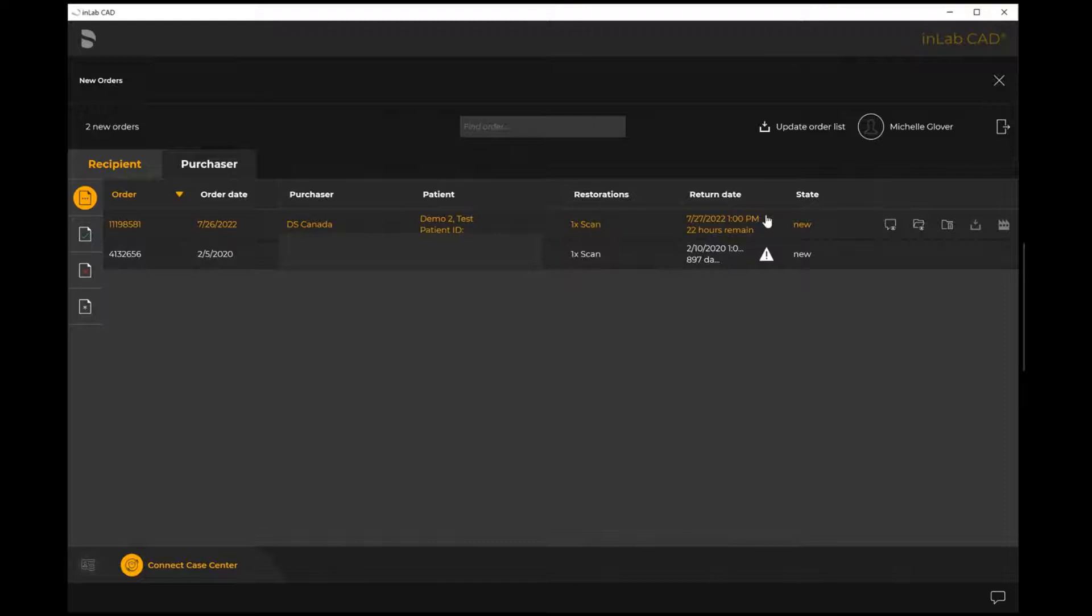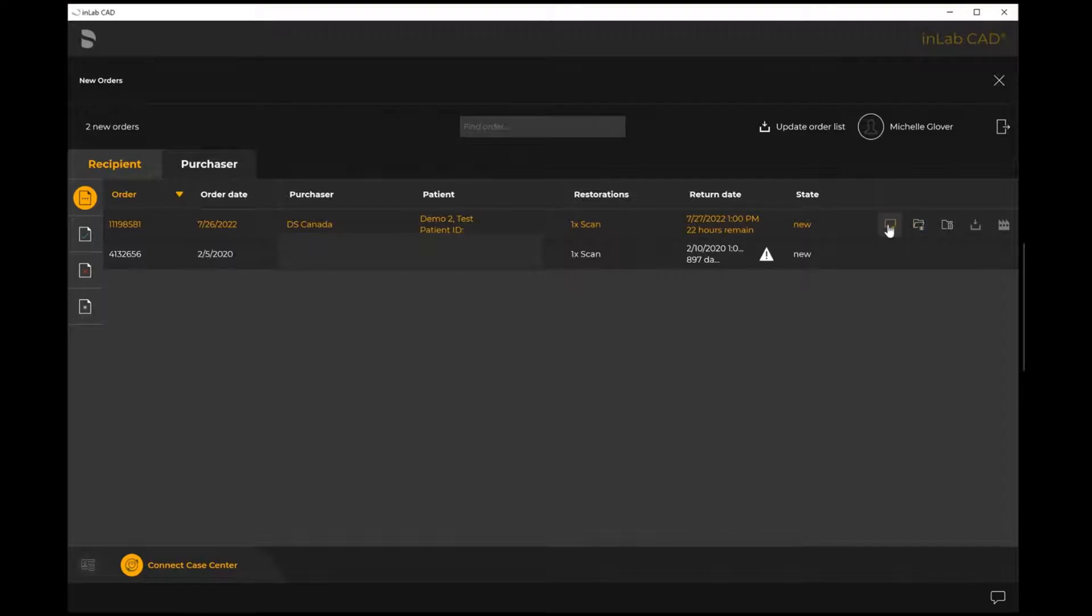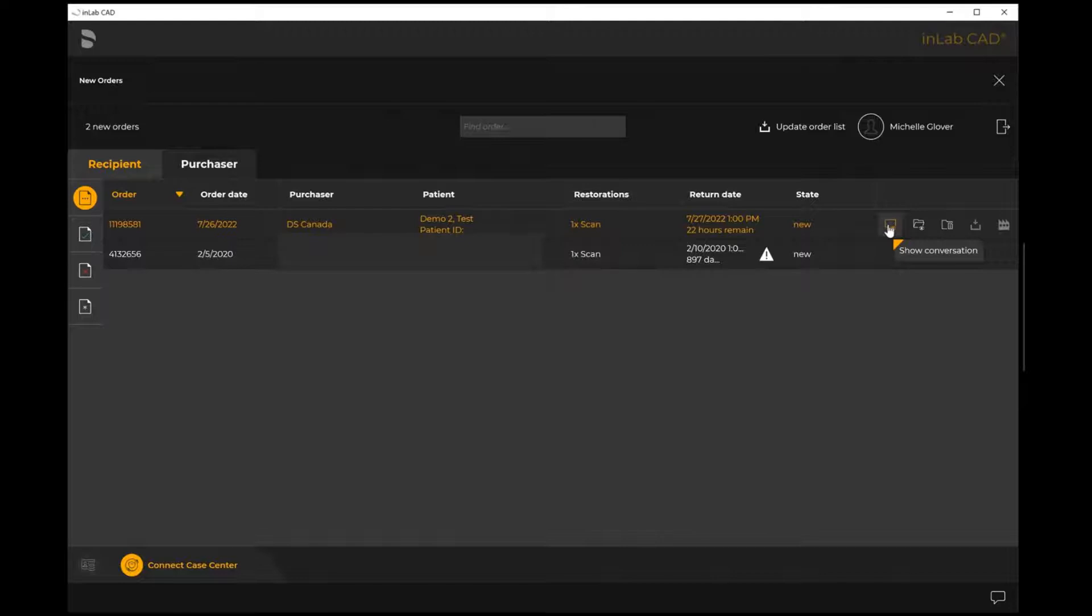As soon as you highlight a case, it'll highlight in that orange color. You'll see right next to it there's three available offerings. The first one show conversation - that would activate a chat between ourselves and the purchaser. It's like a Facebook messenger or an Instagram messenger, sending messages back and forth to one another.